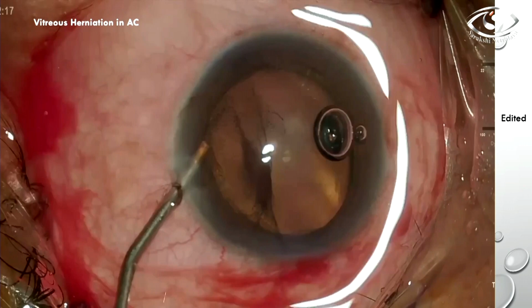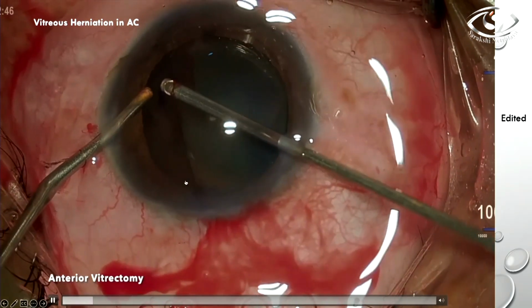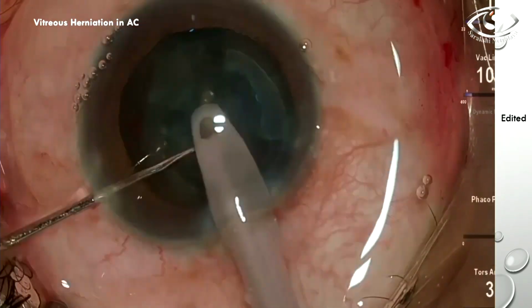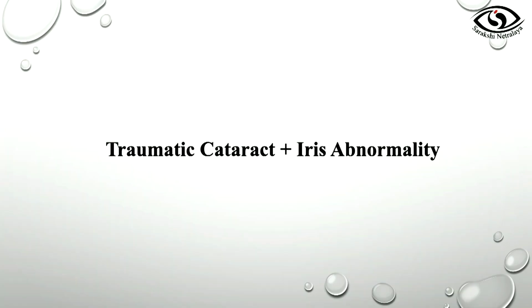Sometimes traumatic cataract is also associated with other morbidities. Here you have a vitreous herniation in the anterior chamber. So before you do a rhexis even, you have to do anterior vitrectomy under visco, and then the rhexis and all steps are managed, the rest were all easy.